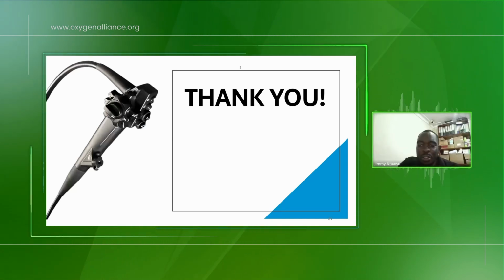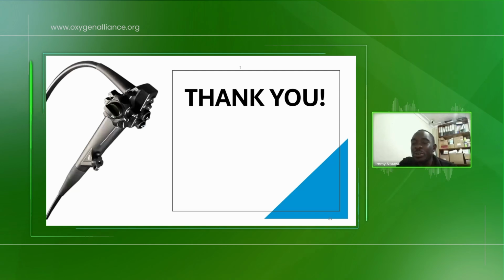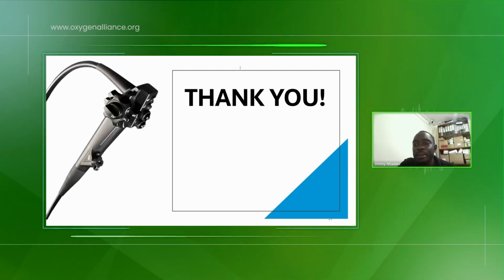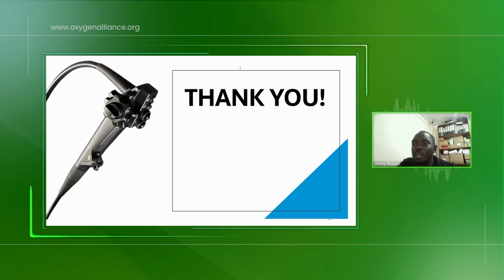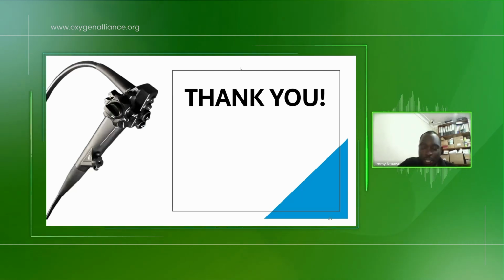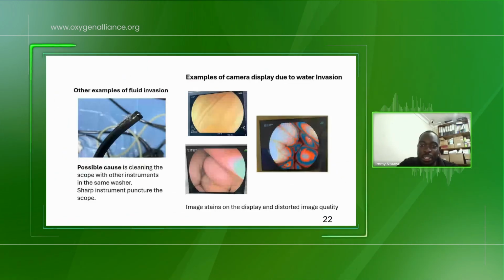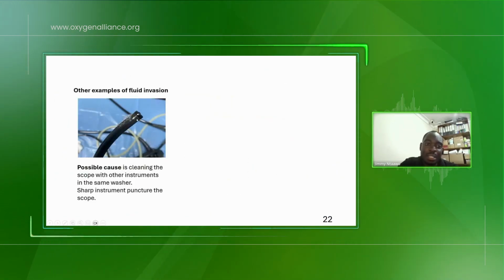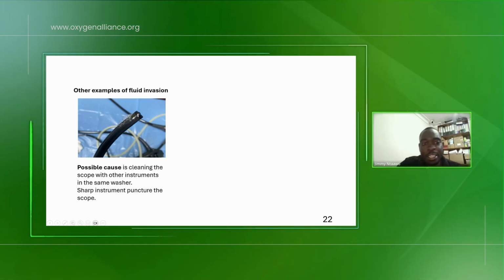Yeah, the coating on the bending section, yes, you can replace it, and it's considered a minor repair, because all you do is, we have what we call epoxy on the scope. Let me see if I can get an image that can show epoxy for the scope. Yes, this black, we call it epoxy, though it's medical graded.